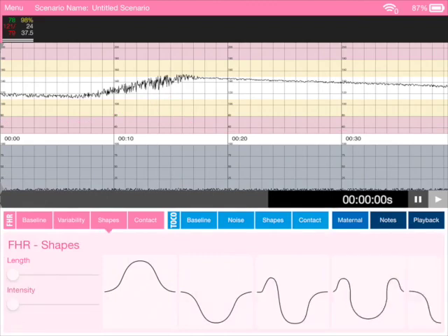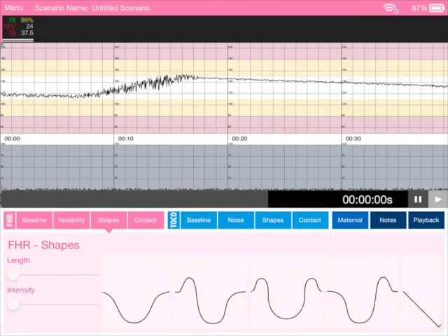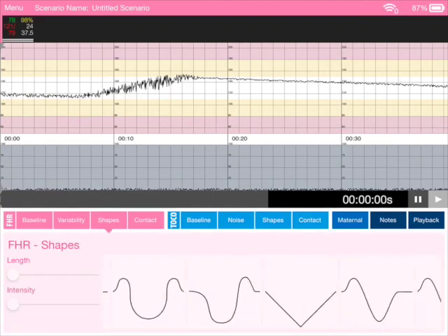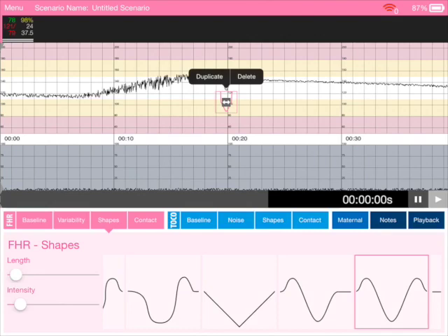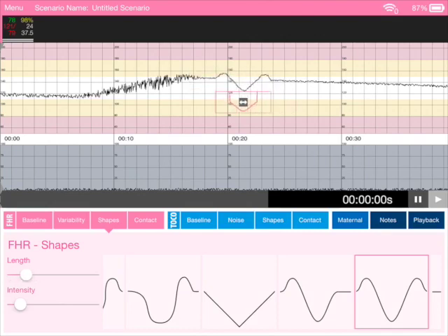Shapes is how we add in decelerations and accelerations. Let's pick one of these here. Let's tap it in and there it goes, it's popped into the trace there and we can increase its length.